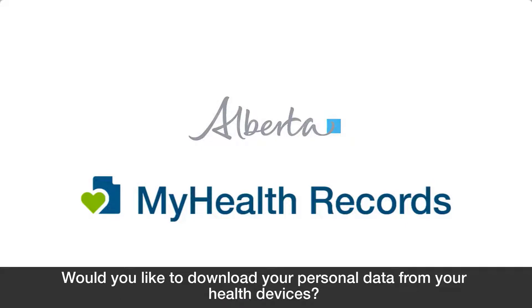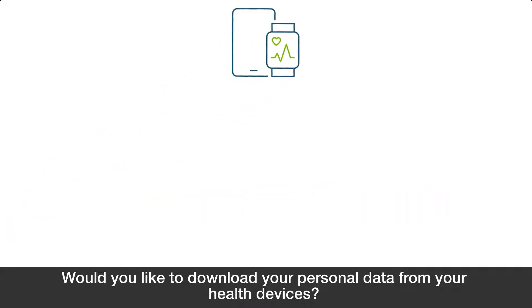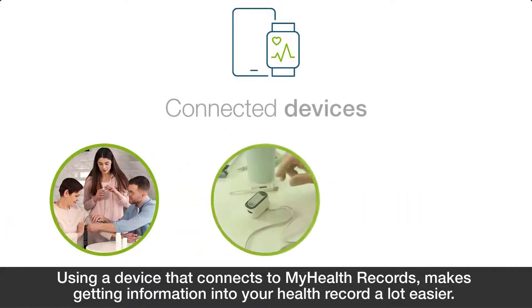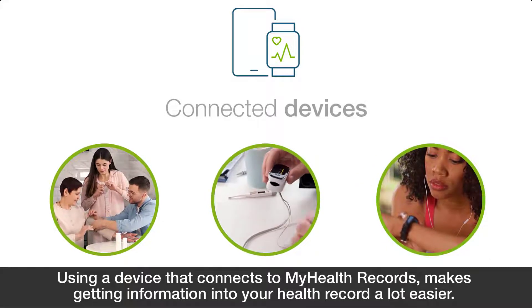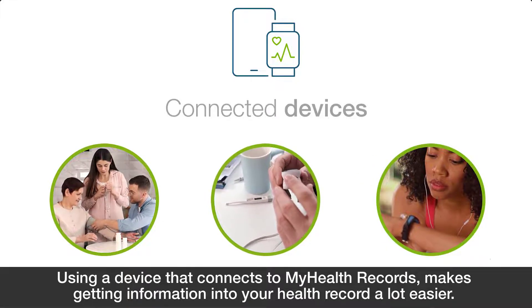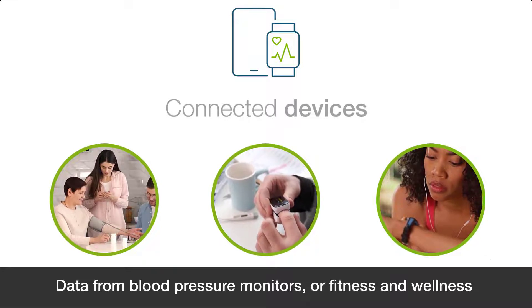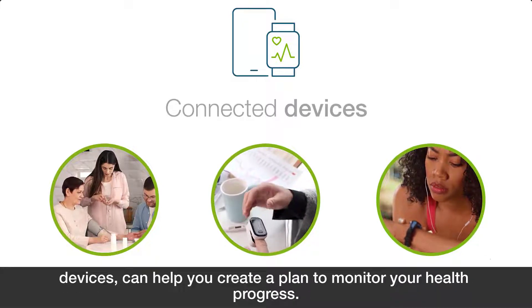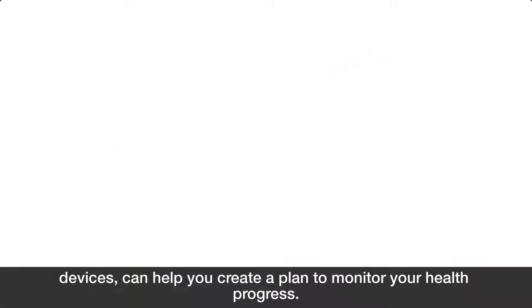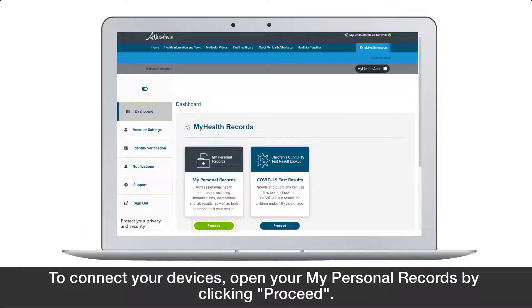Would you like to download your personal data from your health devices? Using a device that connects to My Health Records makes getting information into your health record a lot easier. Data from blood pressure monitors or fitness and wellness devices can help you create a plan to monitor your health progress.